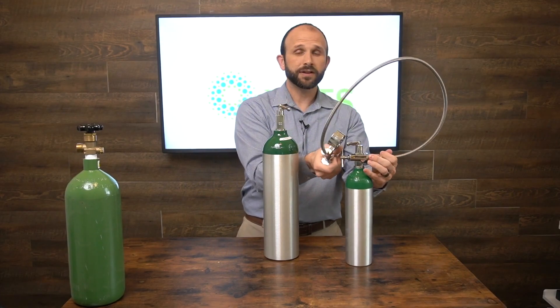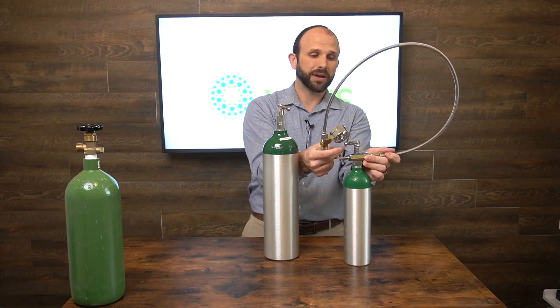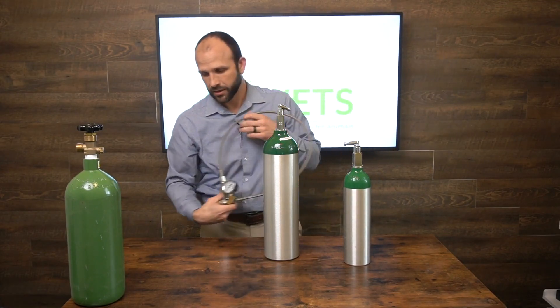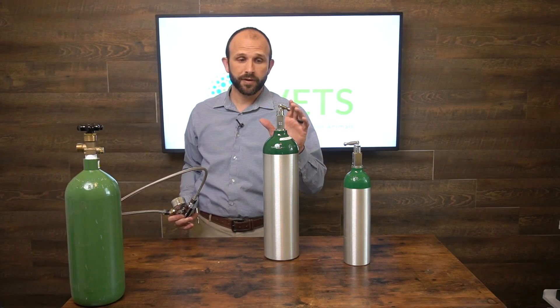When you fill, you want to fill slowly. There are laws regarding filling oxygen in each state, so you'll want to observe those laws — you may or may not be able to do this legally in the state where you live. Just be aware of that.